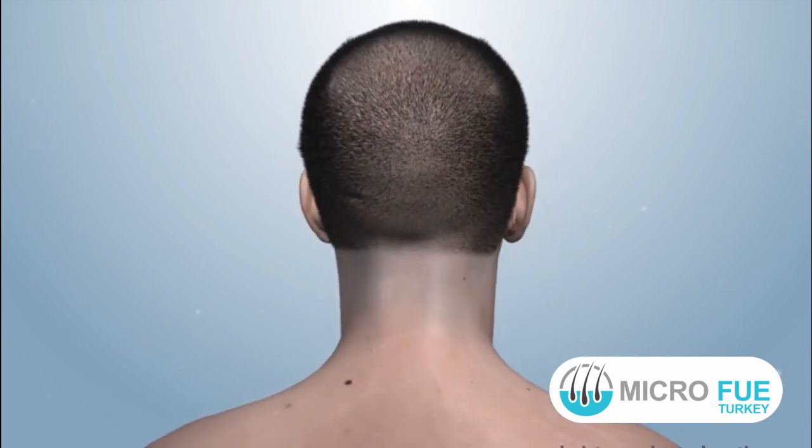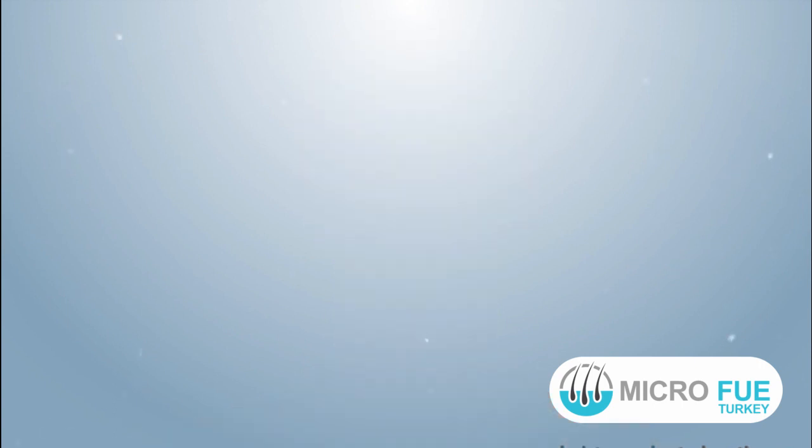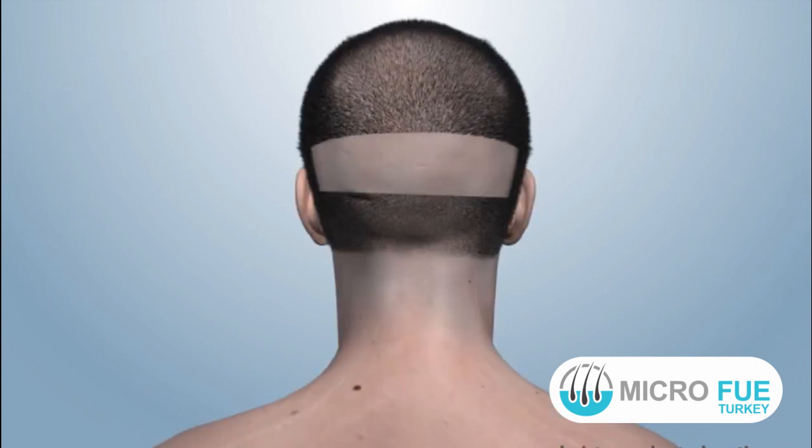The donor area is divided into the safe donor area and high risk of thinning donor area. The complete safe donor area is trimmed, and local anesthesia is delivered on the donor area by injection. Tumescence is given on the donor area for better harvest.